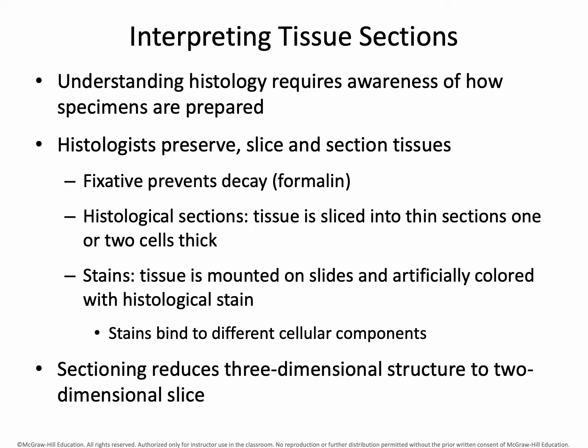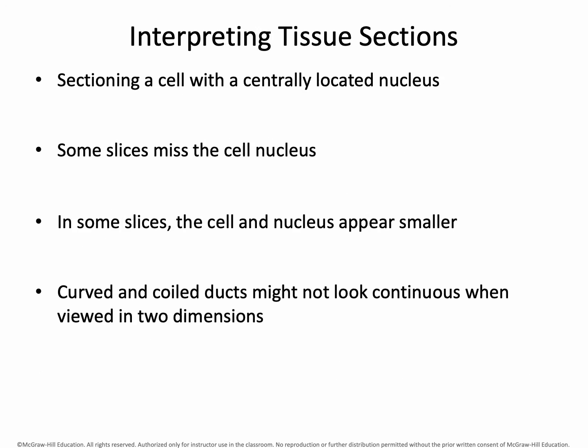Again, I encourage you to go to Google Images and type in a tissue name and see what comes up. All those photos should look similar in some respect or another, but they might look different especially in how they're stained. Tissues can look very different depending on how they're stained. Don't get used to the color of anything. Again, what you see depends on how you slice.